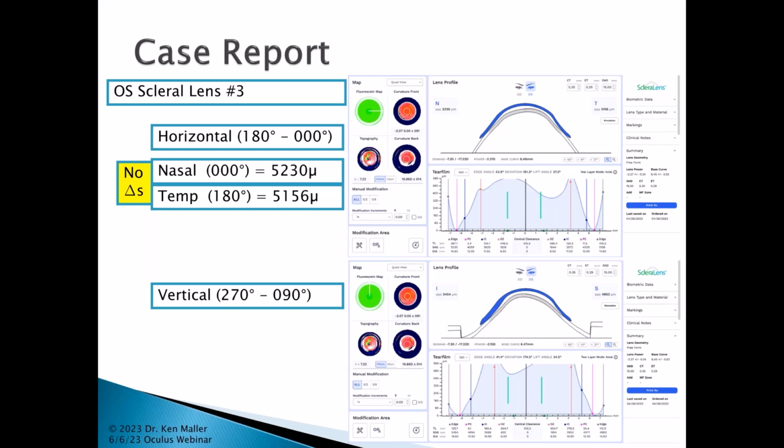The proparacaine will not alter your data at all, and it does make the patient considerably more comfortable, and it is much easier to get their eyelids open. I do remember one particular keratoconic patient who stands out in my mind. On the AXL WAVE, so on this instrument platform, even with the CSP Pro software, he had so much epithelial disruption. I mean, he stained up quite a bit, and it was impossible for me to get his eyes open, even to see the cornea, much less the sclera.